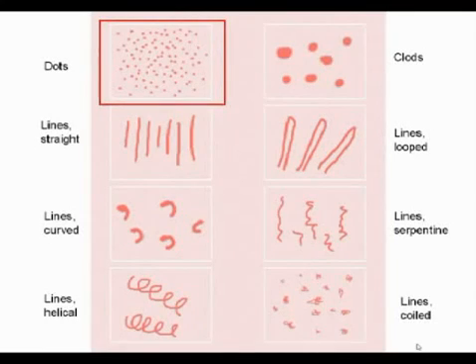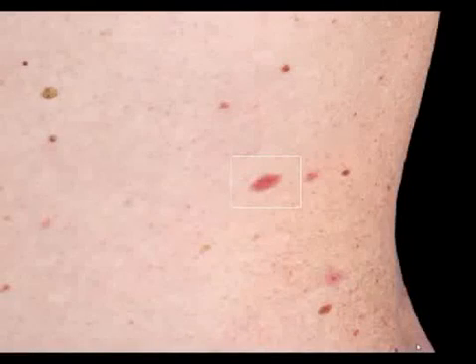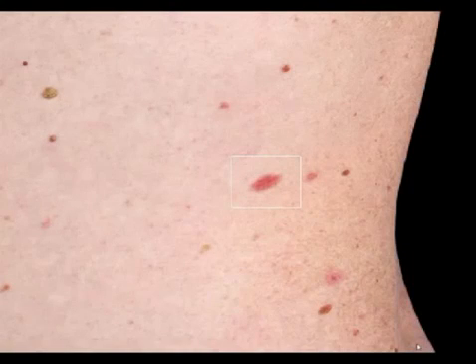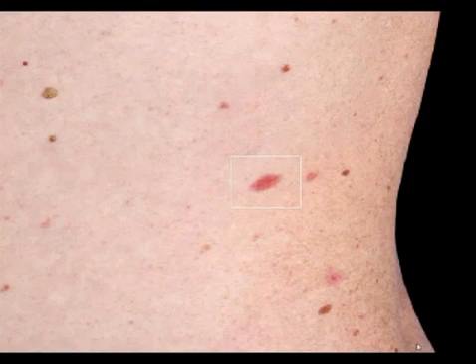Here we have a pattern of dotted vessels. It's a very common vascular pattern in dermatoscopy. This is a nearly unpigmented lesion viewed with the unaided eye, and here the same lesion viewed with dermatoscopy. We can see only a vascular pattern of dotted vessels.